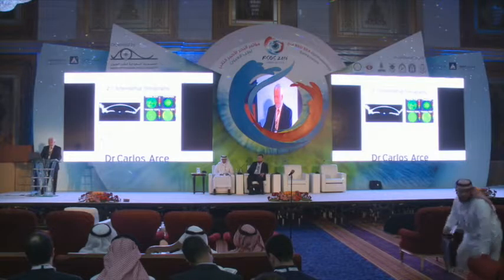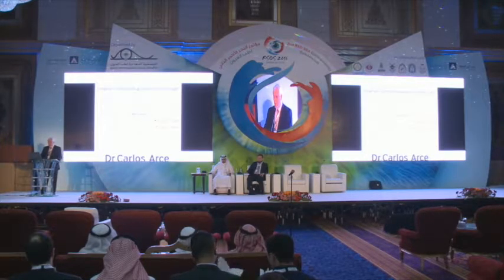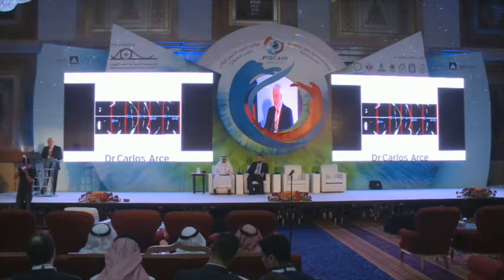On the other hand, Scheimpflug tomography produces optical sections of the anterior segment of the eye. With this technology, we can assess the posterior surface, central data, pachymetry, best fit sphere, toric aspheric maps, or corneal wavefront. However, Scheimpflug alone is not enough, because curvature is derived from elevation by algorithms. So if the system does not detect an elevation difference, the derived curvature will be the same. Scheimpflug alone aligns the data to the apex, and the apex is defined as the most anterior point in the cornea. So if we have an asymmetric cornea, the apex will be dislocated.